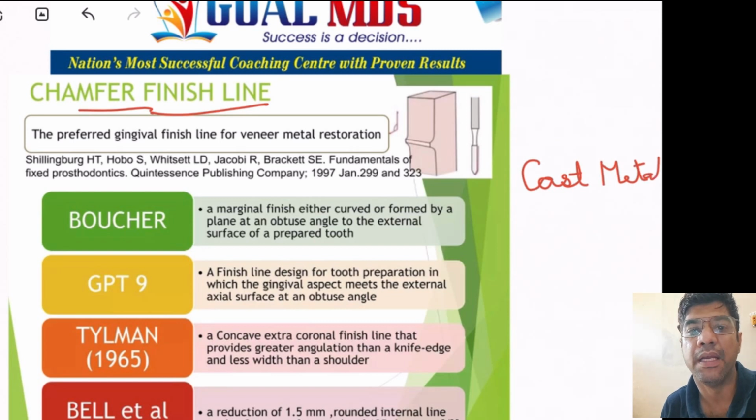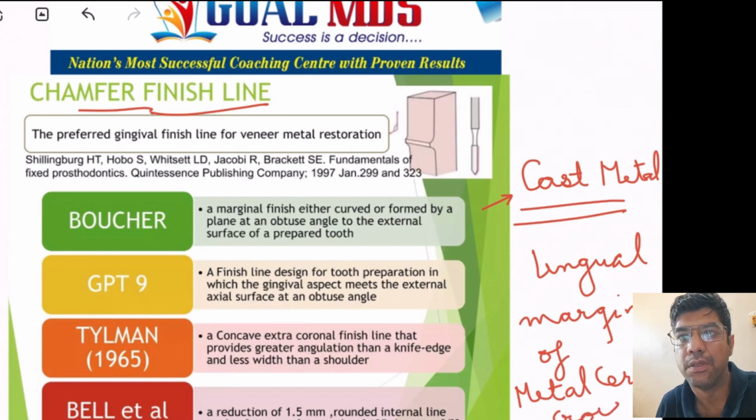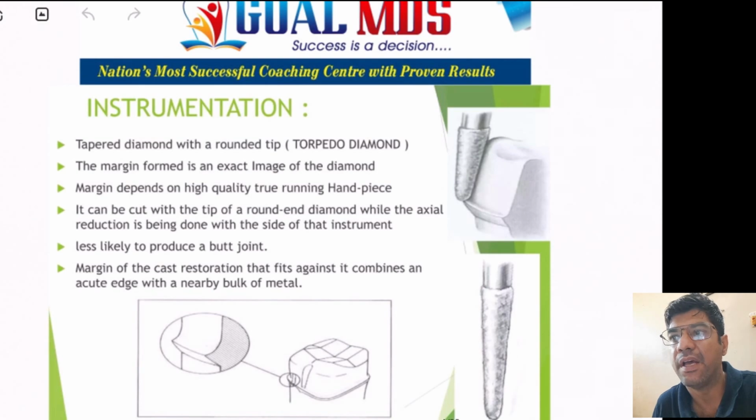So the chamfer line is indicated in the case of cast metal crowns. And it is indicated in the metal only portion of metal ceramic crown along with the lingual margin of metal ceramic crown. So why is it the preferred choice? Why is the chamfer line the preferred choice in case of cast metal and lingual margin of the metal ceramic crown?